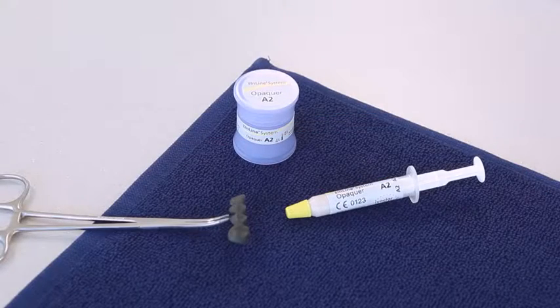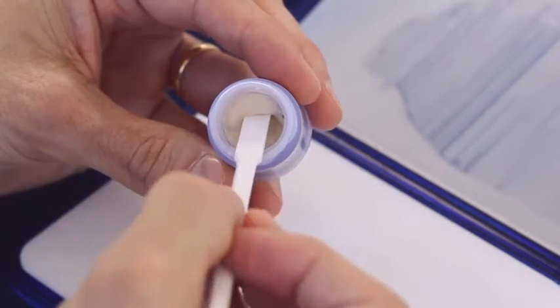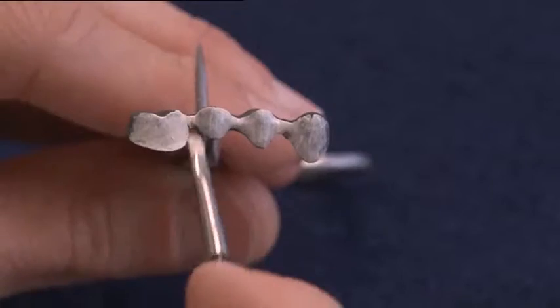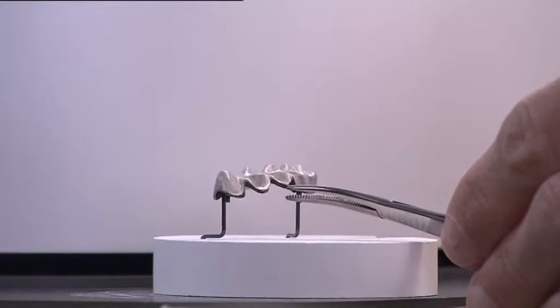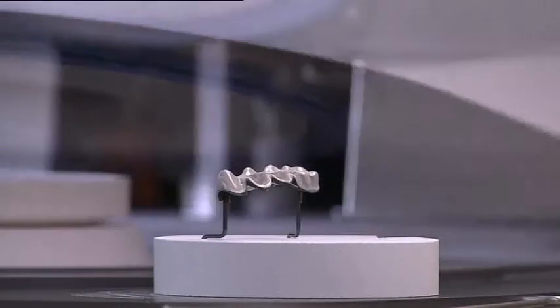Take some ready-to-use paste opaquer from the syringe or jar and mix. Apply a thin layer of wash material using a brush. The framework is adequately supported on the firing tray for each firing cycle. Subsequently, firing is conducted using the firing parameters for the first opaquer firing.